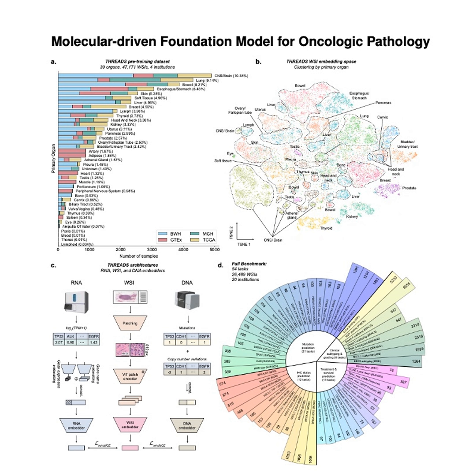Exactly. More morphological context. So once it processes all these patches, and there can be hundreds of thousands per slide, it extracts features from each one. Then another part, an attention-based slide encoder, aggregates all those patch features into one single comprehensive slide embedding. That's the universal representation for the whole slide. Okay, that covers the vision side. Now, what about the molecular data?